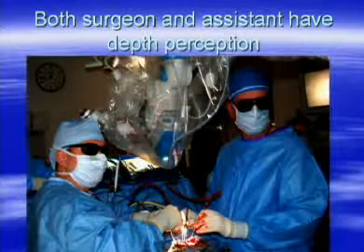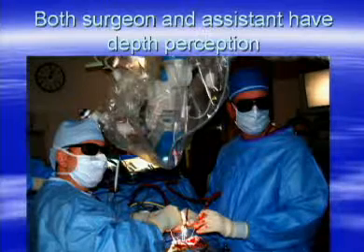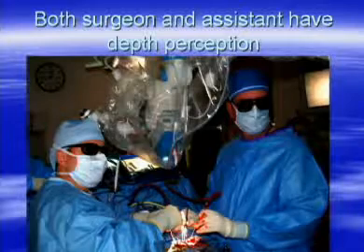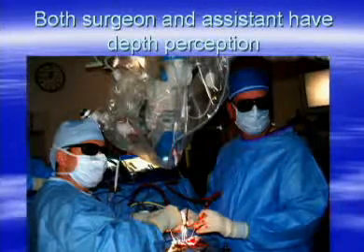My situation is rather comfortable. I don't have to crane my neck looking through a microscope. My surgical assistant is a little height impaired, so he had to kind of crane his head back. But if I had a taller resident, things would look a lot more comfortable.